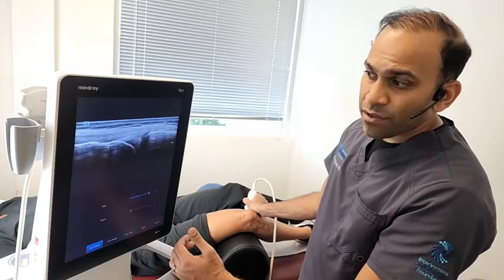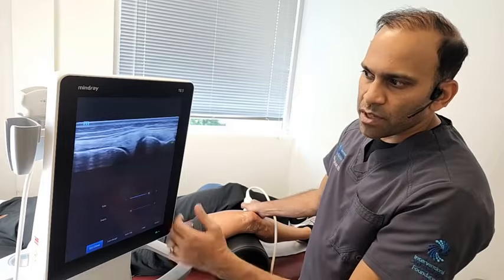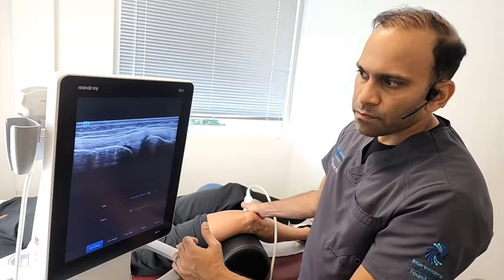Again, every now and then. So it's not a constant pain. It's not something that has to be painful. Other parts of the meniscus actually look really, really good.